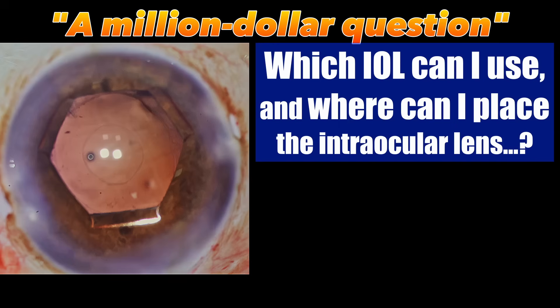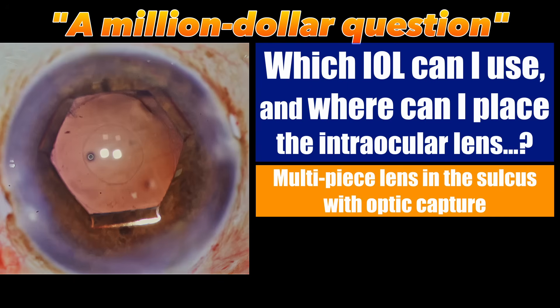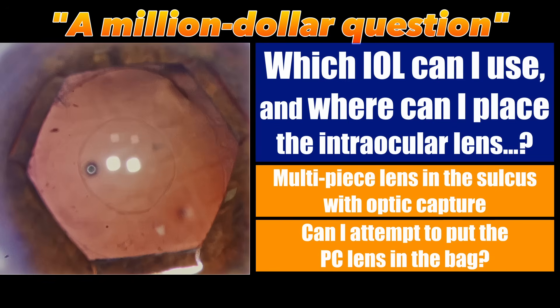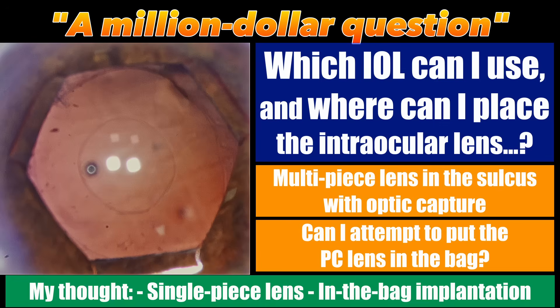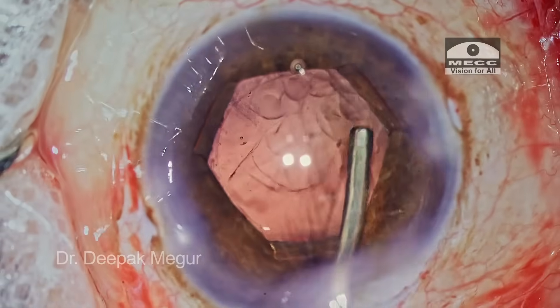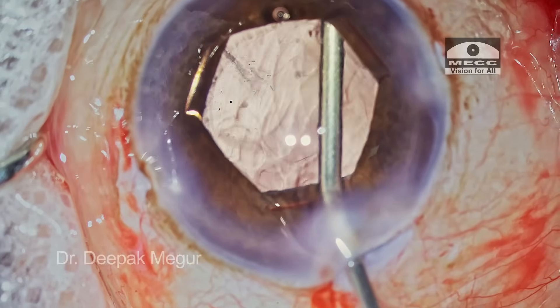The million dollar question: should I go in with a multi-piece lens and inject into the sulcus and then achieve an optic capture, or can I attempt in-the-bag posterior chamber lens implantation as well? Because the posterior capsule tear is so circular it looks almost like a fantastic posterior capsule rhexis, I thought in-the-bag implantation of a single-piece lens would be ideal. We have the single-piece hydrophilic lens that was originally planned for this patient.